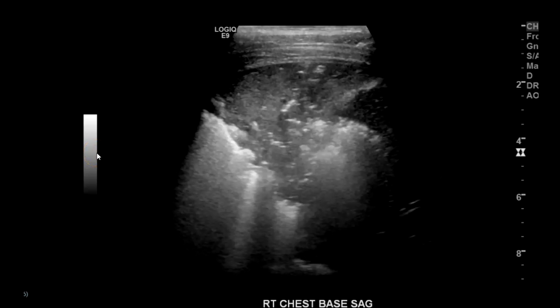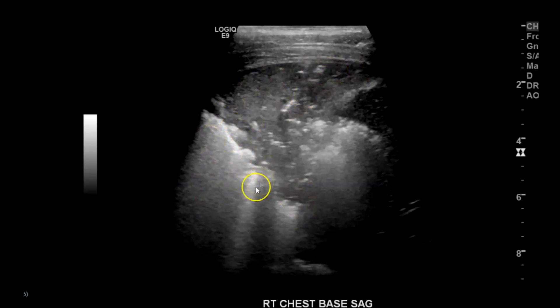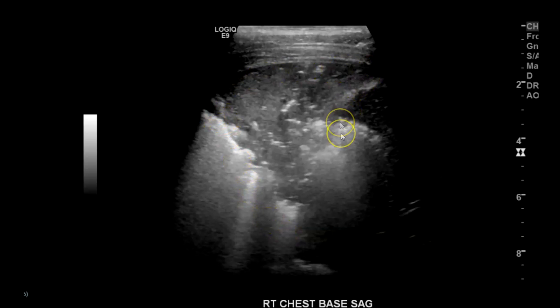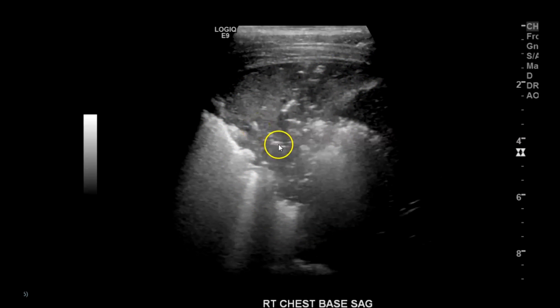On the lung ultrasound, we can see immediately at the chest base that there's consolidation. So here we have air, and this is the lower part of the lung. With consolidation, you can see some air bronchograms here. So these are little air pockets.